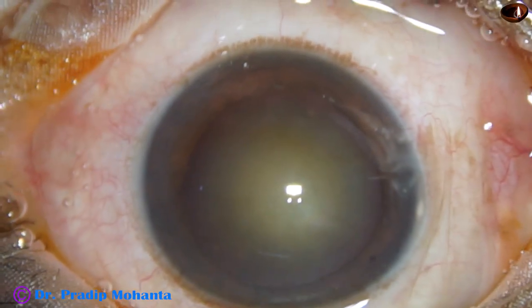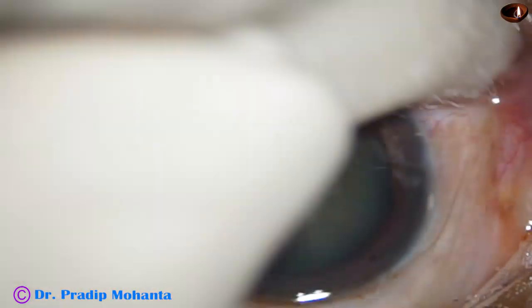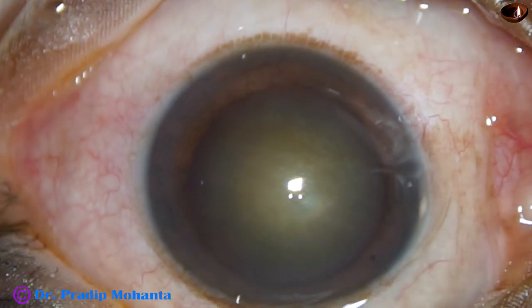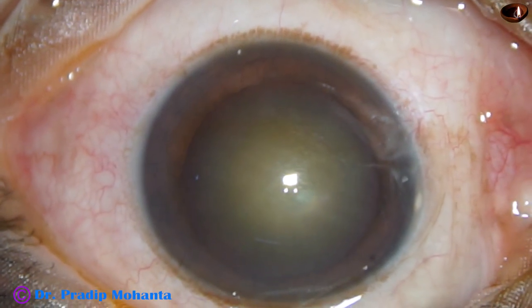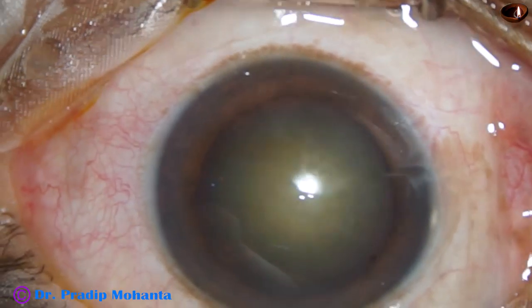A few drops of povidone iodine 5% are instilled over the ocular surface, and the ocular surface is thoroughly irrigated with BSS or Ringer's lactate. This is a very important step — please don't neglect this step.